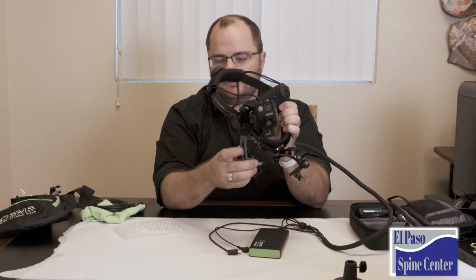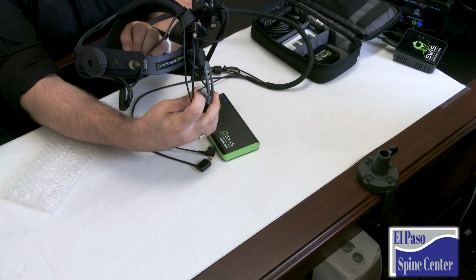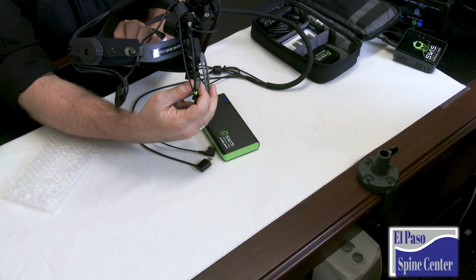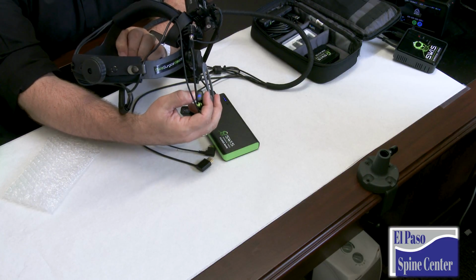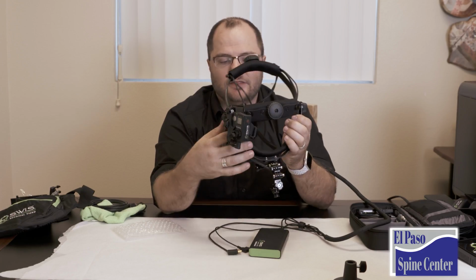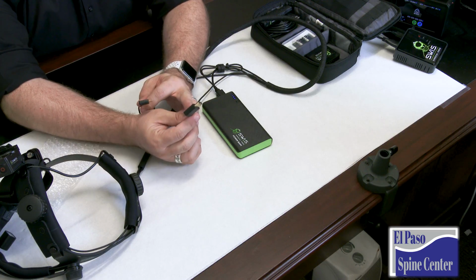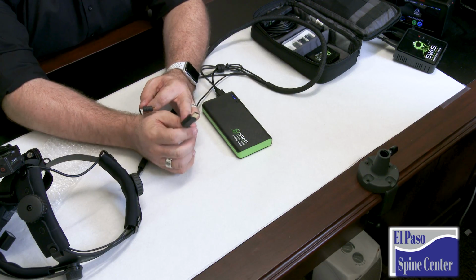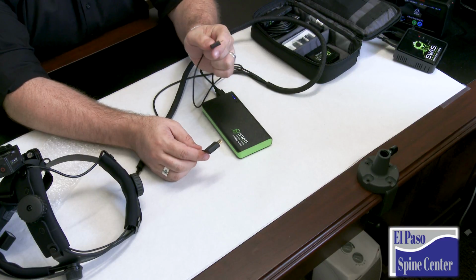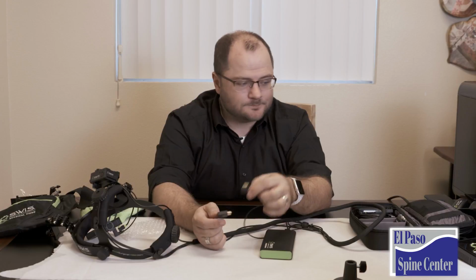Now, on the Viewfind, the power button is in the back, so you can actually press that down, and it'll flash blue, and in just a minute it'll turn off. You're not going to see anything. That's because, remember how there are 2 HDMI cables? The HDMI that's full size comes out of the GoPro. This mini HDMI is attached to the Viewfind. There's no signal between the two.